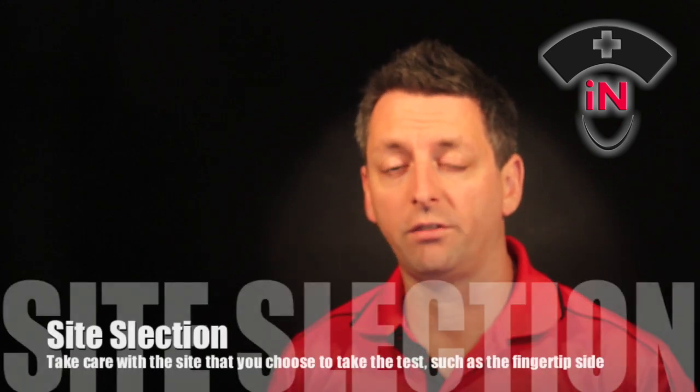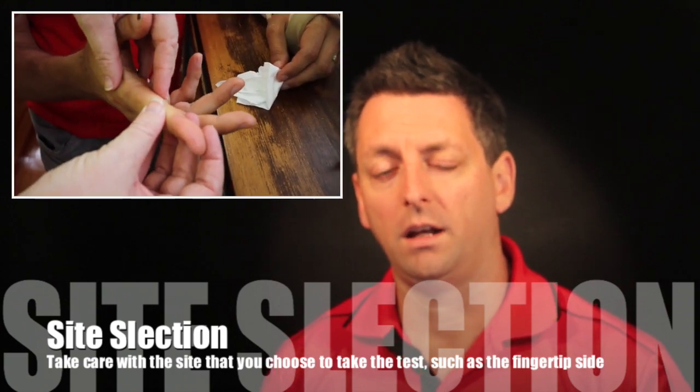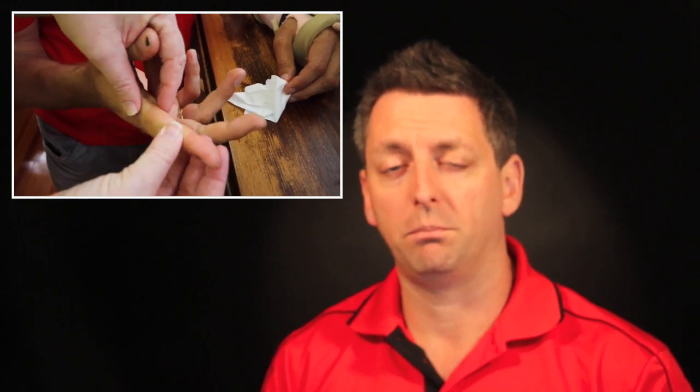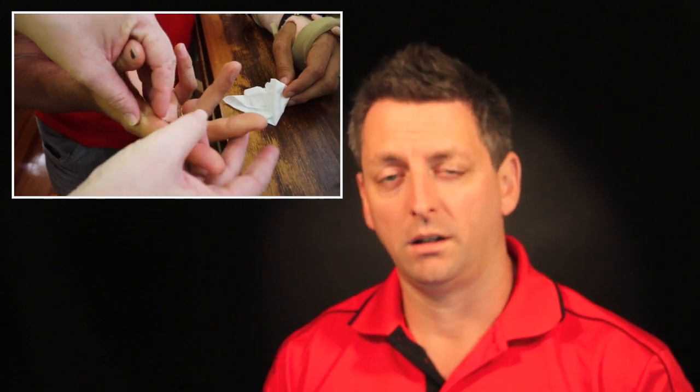The places that we take a blood sugar are on the sides of the finger. I never use the finger pad itself because there are a lot of nerve endings there, and diabetics who have regular blood sugars done get decreased sensation in their fingertips. If you stick a needle in where they've already got decreased sensation, they're going to lose more sensation. So to maintain as much sensation as possible, I always go for the sides — and the sides give you just enough blood as well.